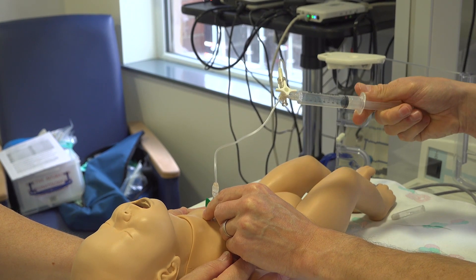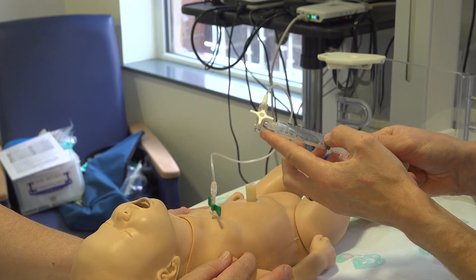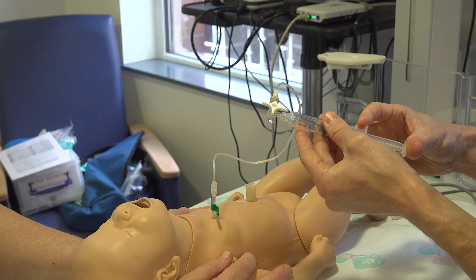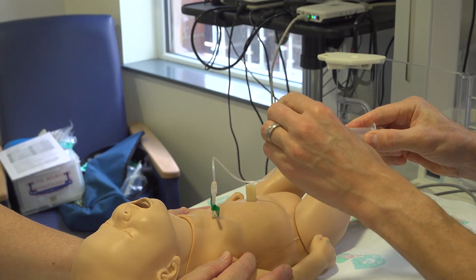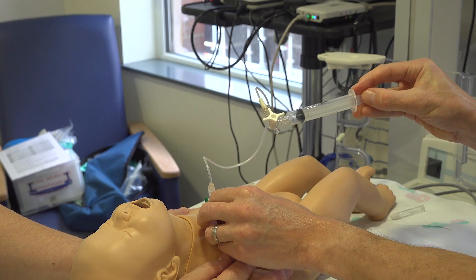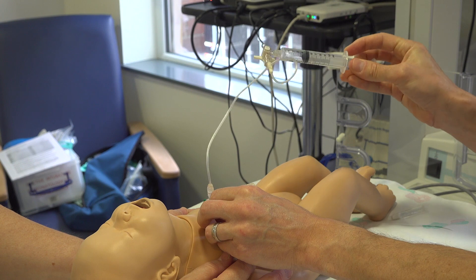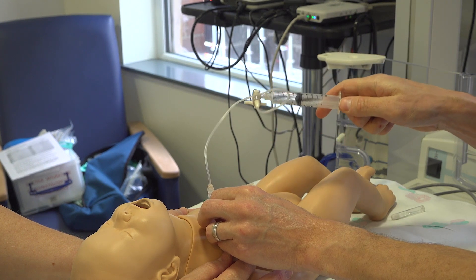Once you reach 10ml you can open to the atmosphere, discard your air, open to baby and continue to drain until you've completely drained all of the air, at which point you will meet resistance.